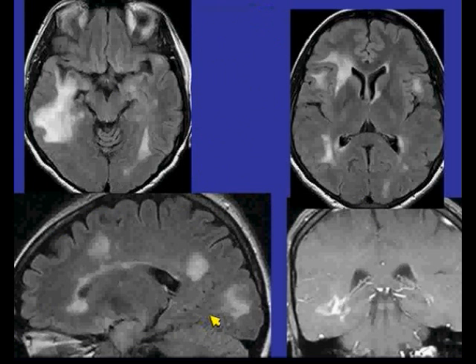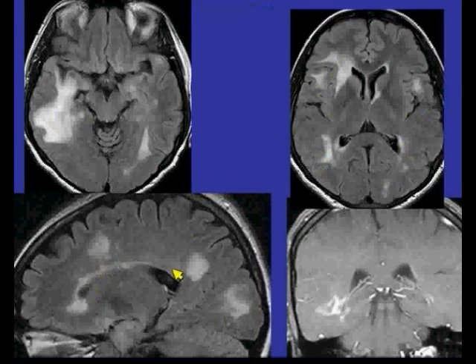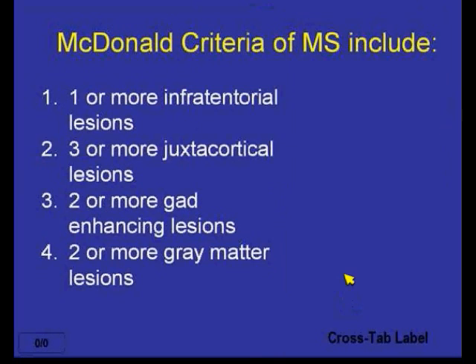This is a patient with multiple sclerosis. As you can see, it's more confluent disease than is typical. This is a case we initially were considering ADEM — it does involve regions around the corpus callosum and had some unusual enhancement — but this is a patient with multiple sclerosis. When we think about MS, one important factor is reporting in your reports in a way that helps the clinician make a diagnosis, and to do that you have to know the McDonald criteria.